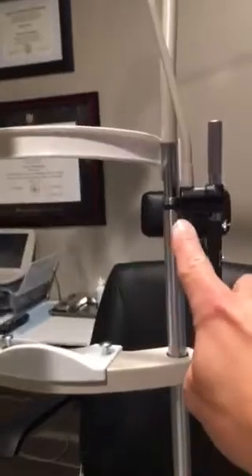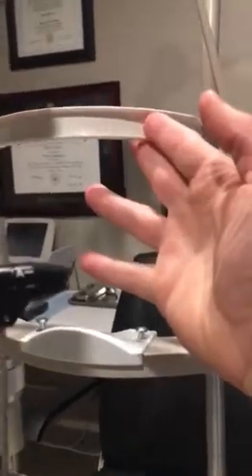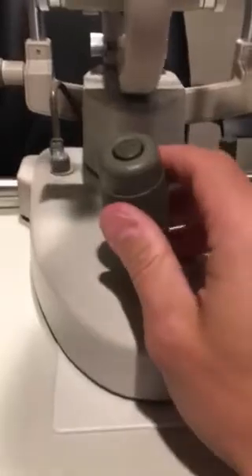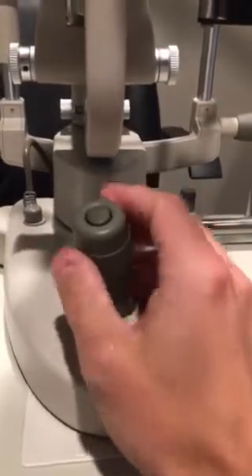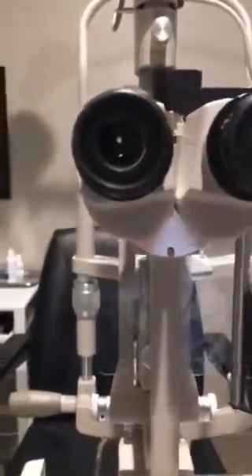Have the patient put their chin in the chin rest, forehead against the top bar. Line the lateral canthus of the eye up here at the black line. When the patient is in — forehead against the top bar and chin in the chin rest — you will push the lamp forwards towards them until it comes into focus. Fine focus will then be done by pushing the joystick forward or back. I can raise or lower the light position with the joystick.